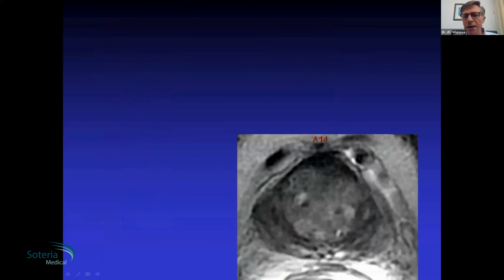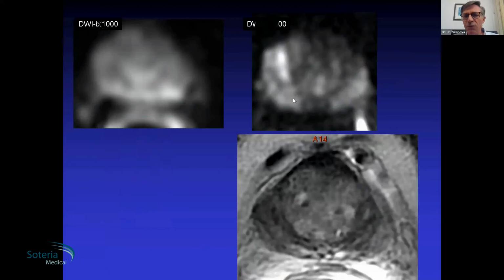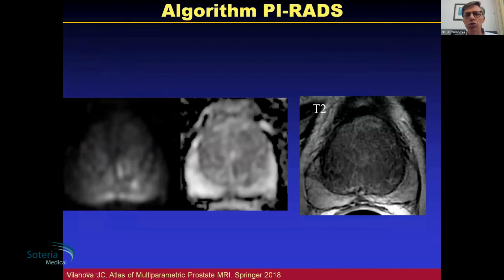Because here on the T2, we might not see any significant area. Not either here on the diffusion, but this is the same diffusion. The big difference is that this is high b-value, this is lower b-value. So the same patient, we can see that I would score a PIRADS 2, and this patient has a significant lesion because I have to read the high b-value. Otherwise, I'm not going to detect the significant lesion. I have to display the 4 sequences. I have to adjust properly, markedly low, markedly high. I measure on ADC, and before any reading, if the patient has a previous biopsy, read the T1. Then I am going to start with the periphery.